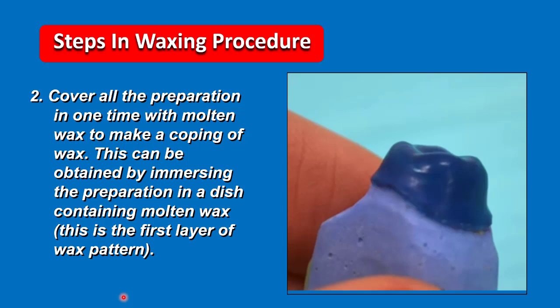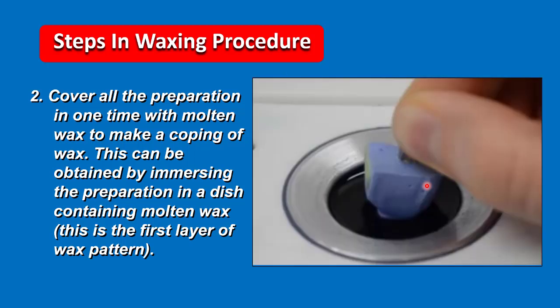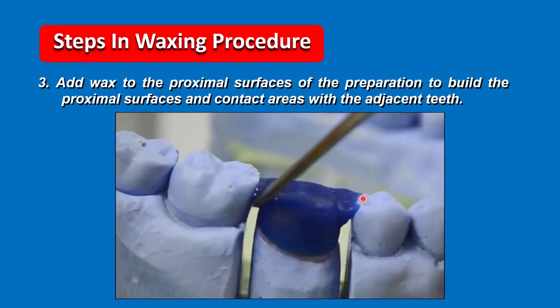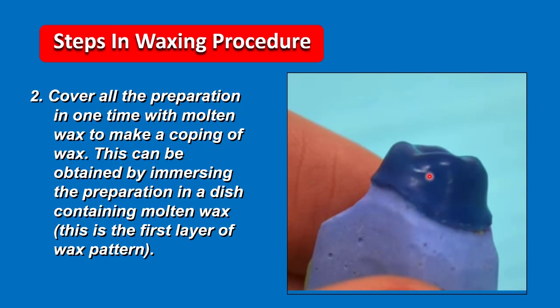Step 2 in the wax procedure is that we should cover the die with a uniform thickness of wax. This may be done by adding increments of wax one on top of the other, but this is not indicated because it may trap air bubbles between the layers. So the correct procedure is by dipping the die in a container of molten wax. This is the first layer, on top of which layers of wax are placed to form the tooth anatomy.